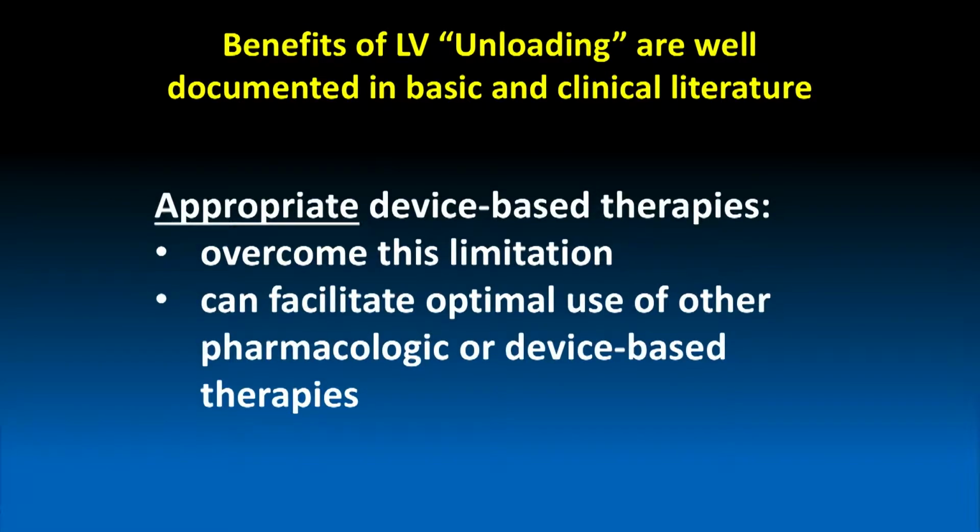But appropriate device-based therapies can overcome these limitations. And in fact, as we heard last year, and you'll hear more, the combination of devices and drugs or non-device therapies that also reduce the workload on the heart, the power expenditure, can have synergistic effects. So this is really the essence of why we're here: we're going to be discussing the use of devices that can provide appropriate unloading of the ventricle.